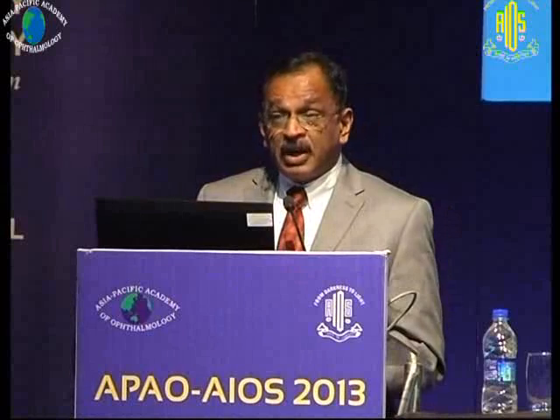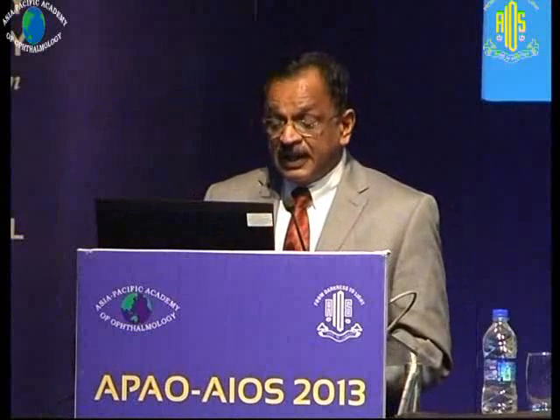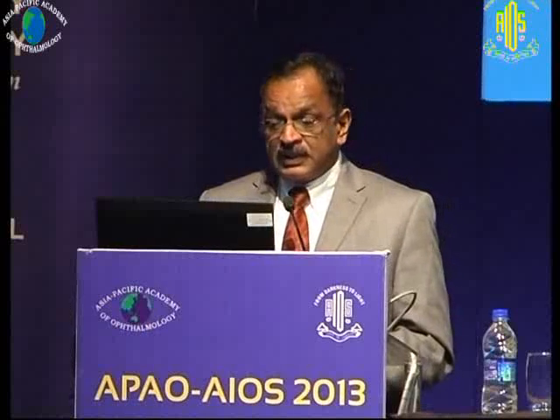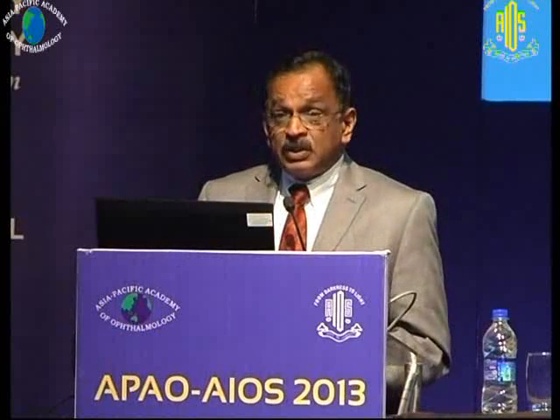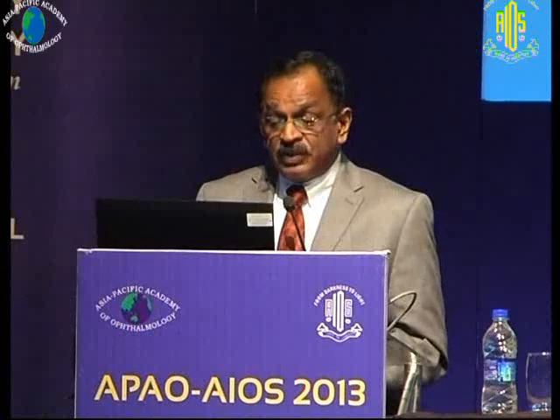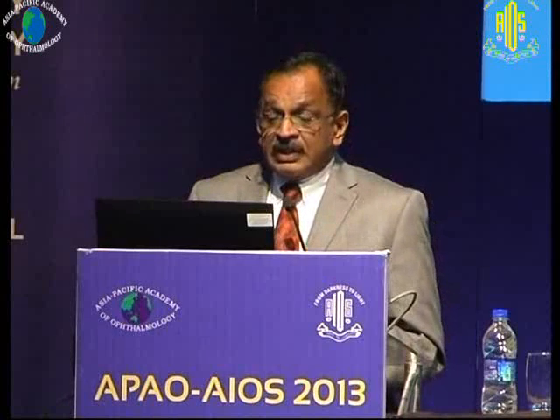So the intraoperative complications: you could have hemorrhage, retinal pigment epithelium or choroidal damage, or subretinal migration of perfluorocarbon liquid, which could sometimes be a real headache in these cases. Philip had clearly shown the retinal slippage, how it can happen in fluid-air exchange. In these situations, especially in giant retinal tears, a direct perfluorocarbon liquid or silicone oil exchange would help.